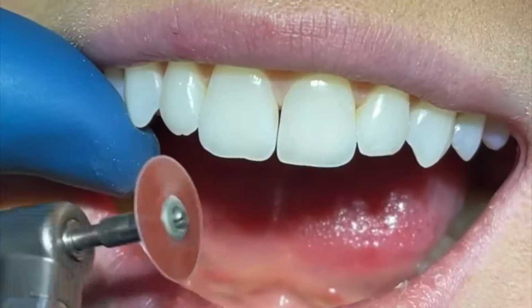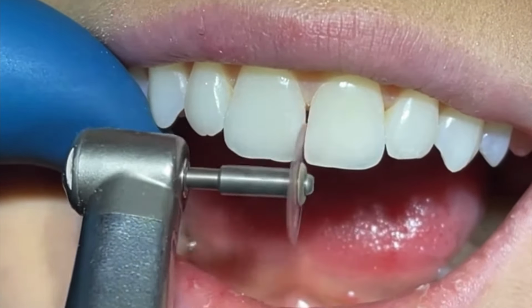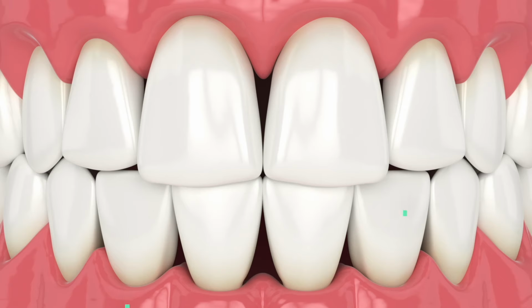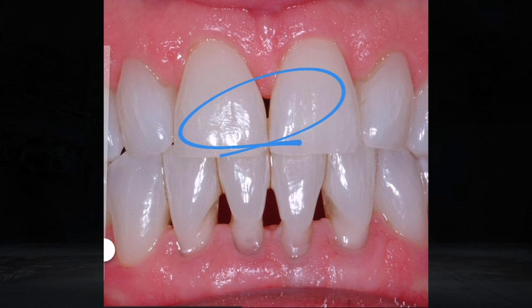Another thing to expect during your Invisalign treatment is something called IPR, or interproximal reduction. What this is, we go and polish between certain teeth, and there are several reasons why we do this. One could be that you don't have enough room for all the teeth, so this will help create space for them to fit. Another is called a black triangle, usually due to a triangular shaped tooth where the gums don't fill in, and although the teeth are touching, it looks like a space.